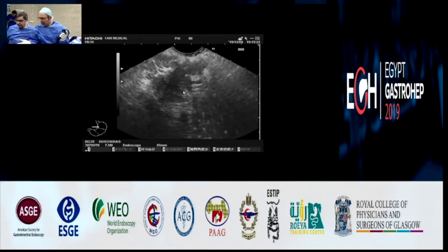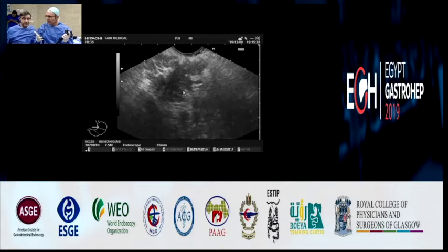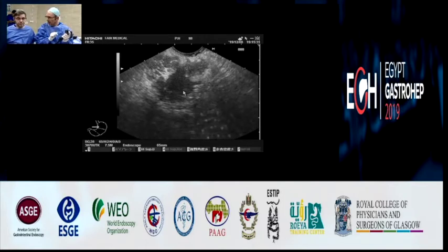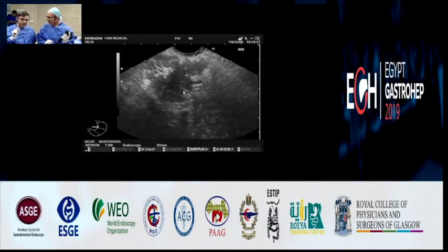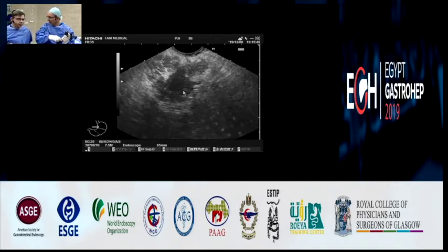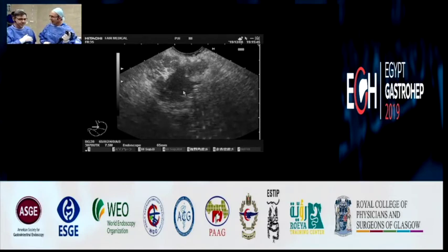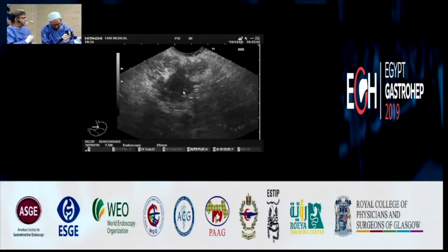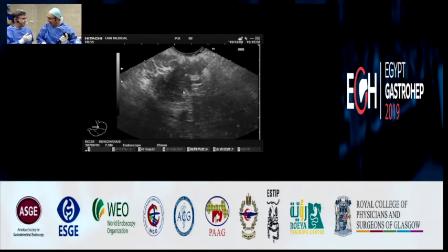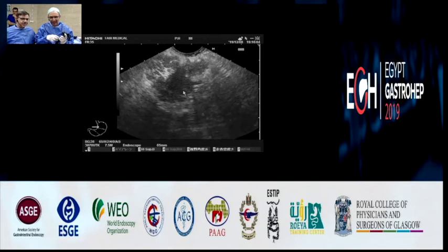And here we have the Franseen needle, called Franseen because of the design of the tip of the needle. The Franseen needle is a very old needle. The design was done in the 1980s for the diagnosis of breast cancer. It was later abandoned for many reasons in favor of the cutting needle, and now it comes back with EUS. That is an old story for this needle.